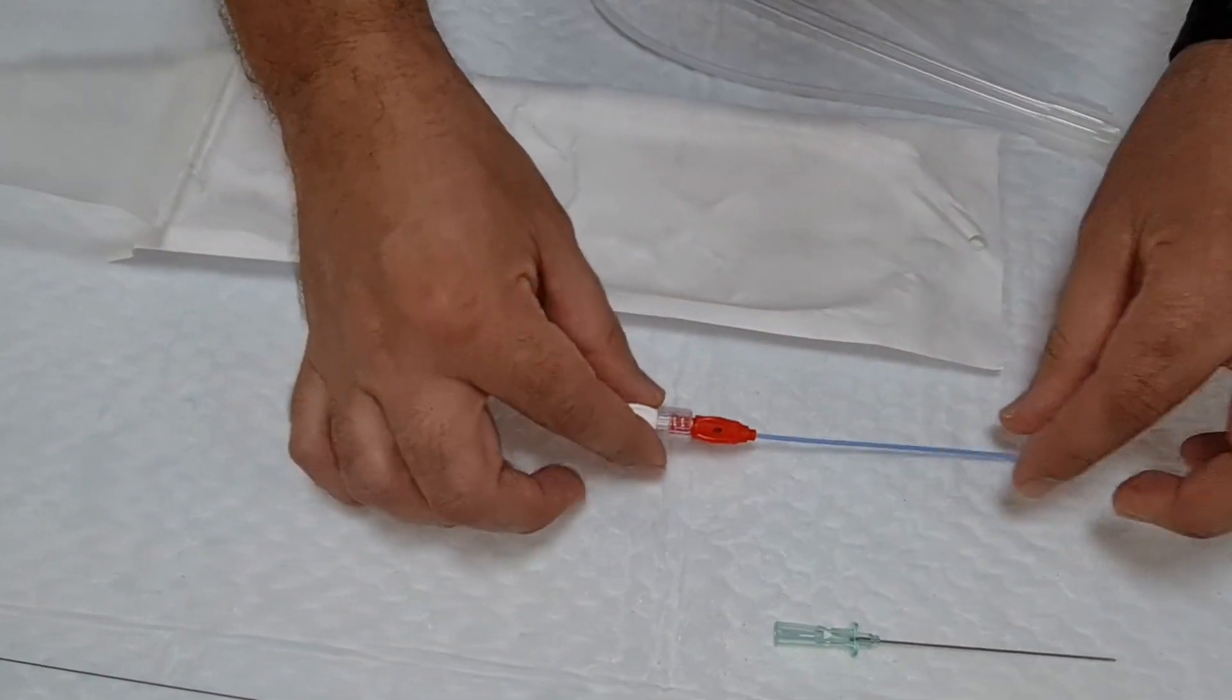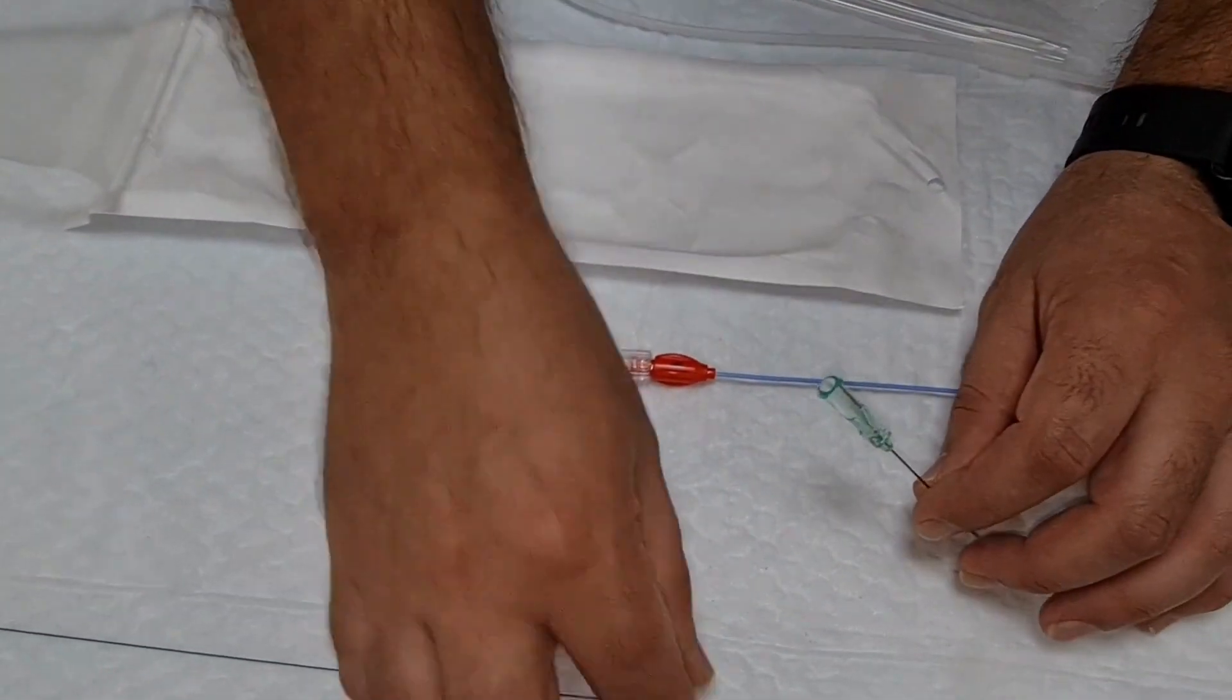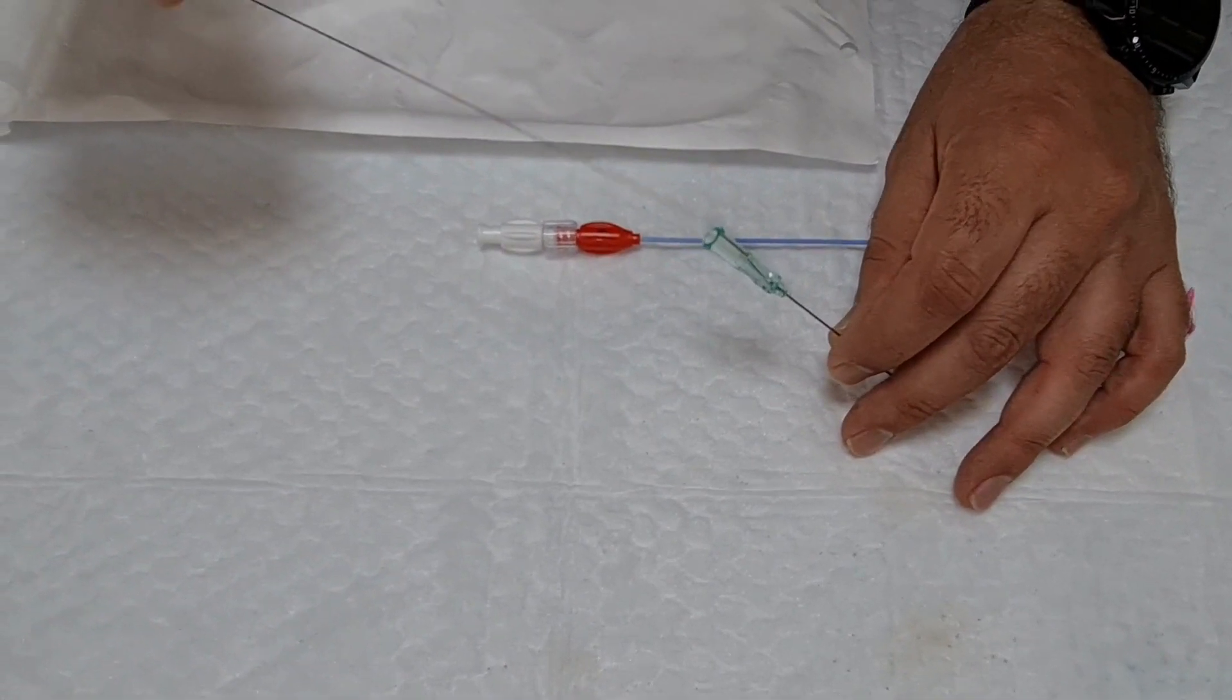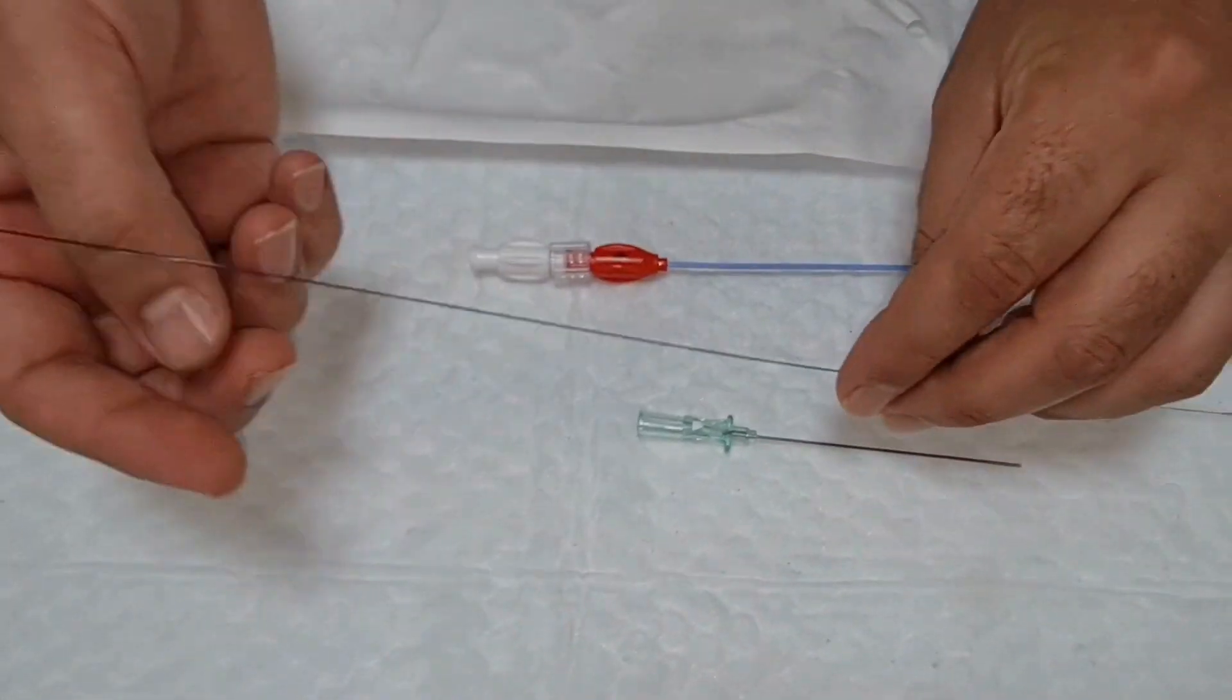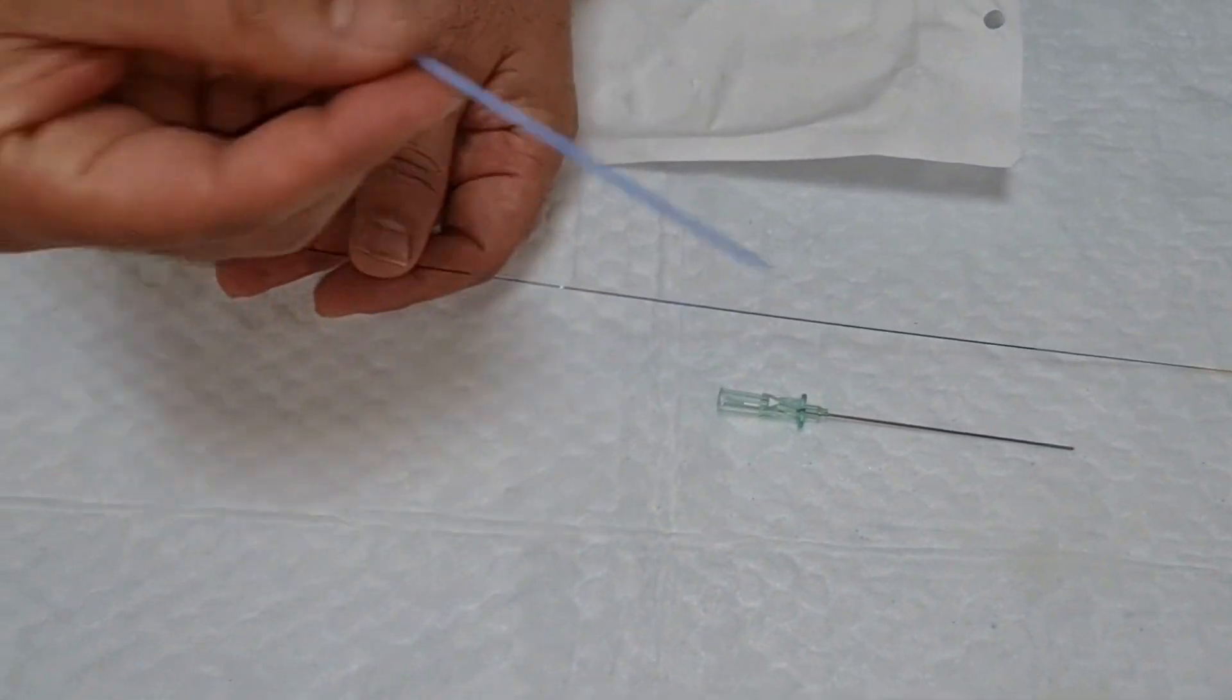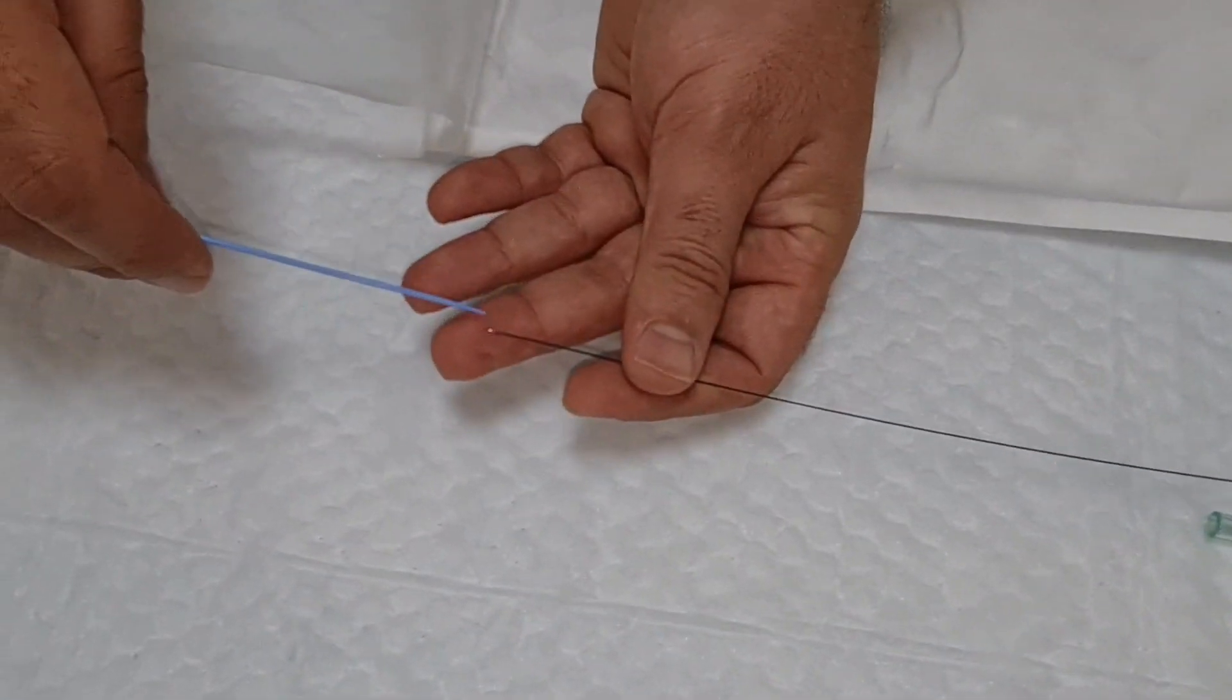Once you lock, keep it aside. So once the doctor takes the puncture, the wire goes inside the needle. When it goes inside the needle, then you have the micropuncture to load over the wire.